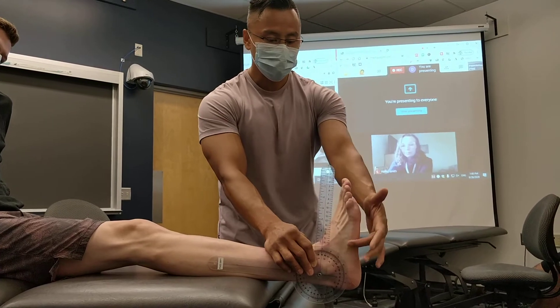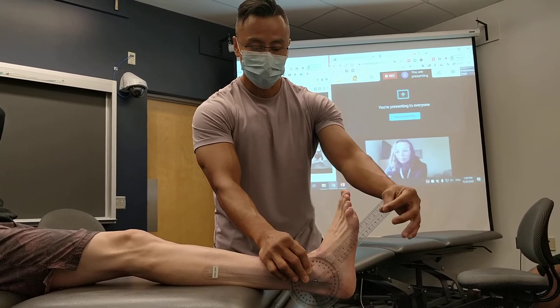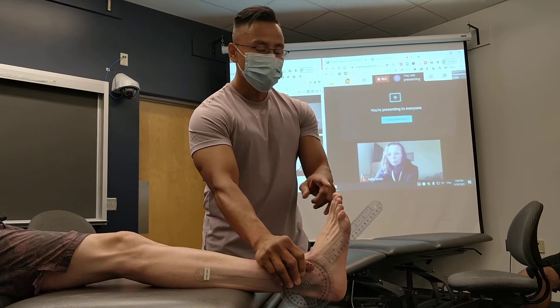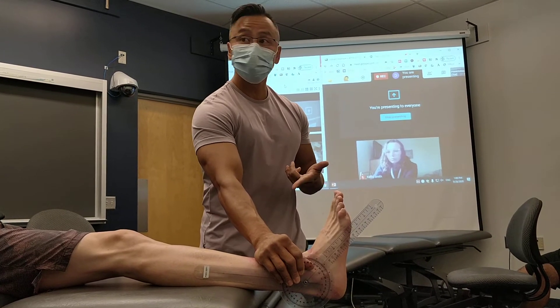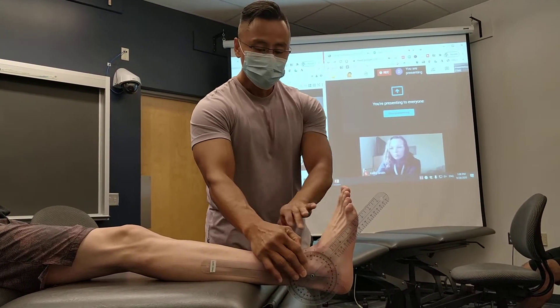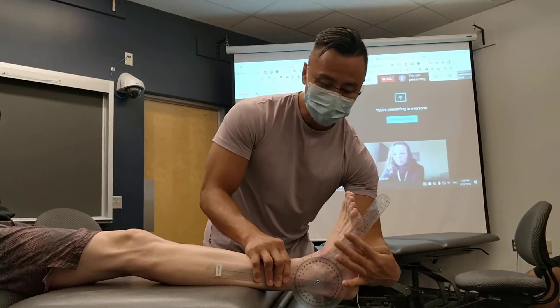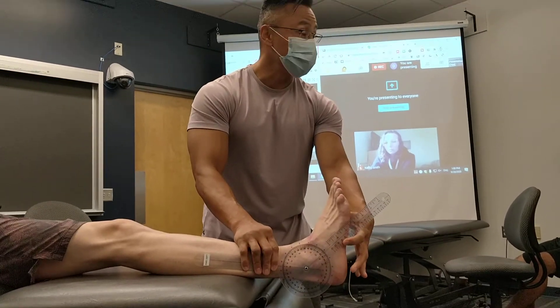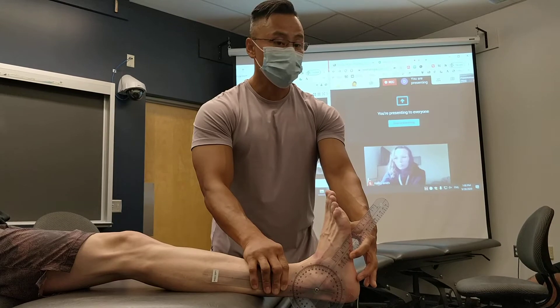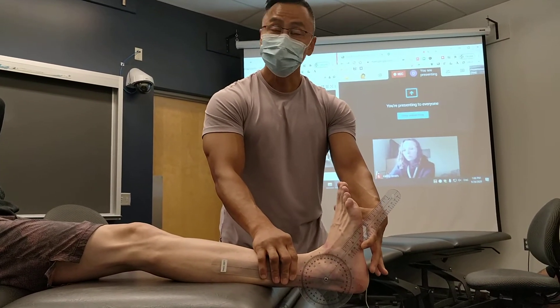What you'll realize is if you're going to use the base of the fifth, you have to zero this out — which means you have to align this with the base of the fifth while this arm is perpendicular. So this is your new adjusted zero, whatever the number is. Now this is the zero, holding everything where it's supposed to be. We're going to have the patient — I'm just eyeballing this — base of the fifth. Now we're going to dorsiflex, and that's the difference. Between that first angle and this new angle, that's your amount of dorsiflexion from zero.